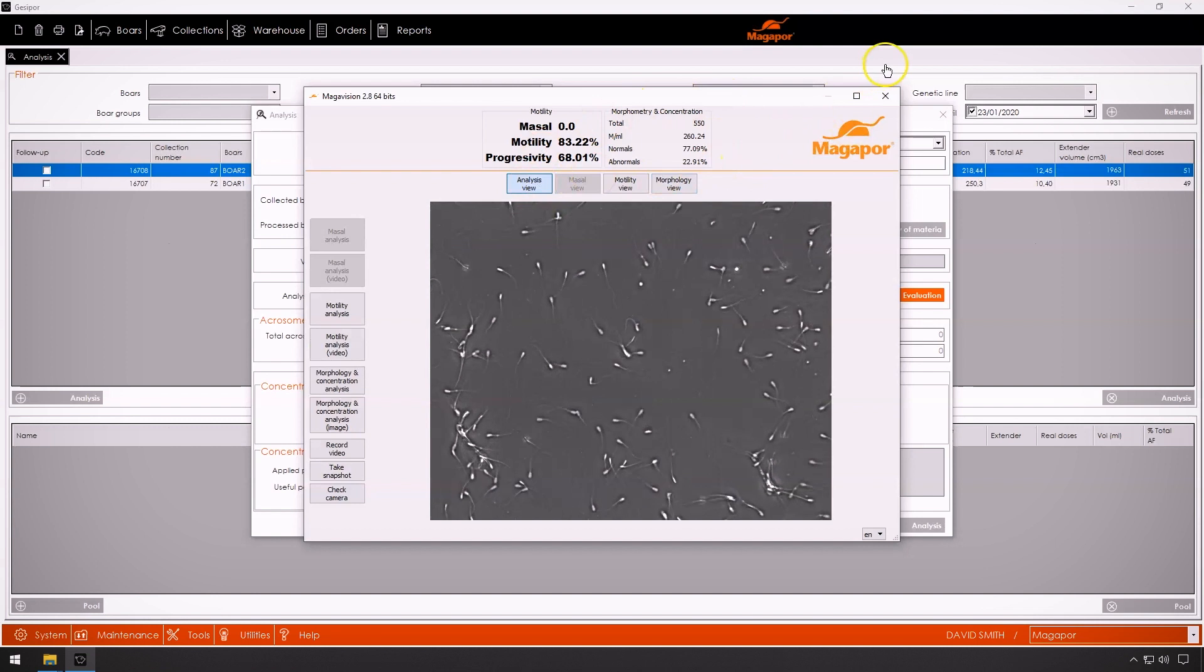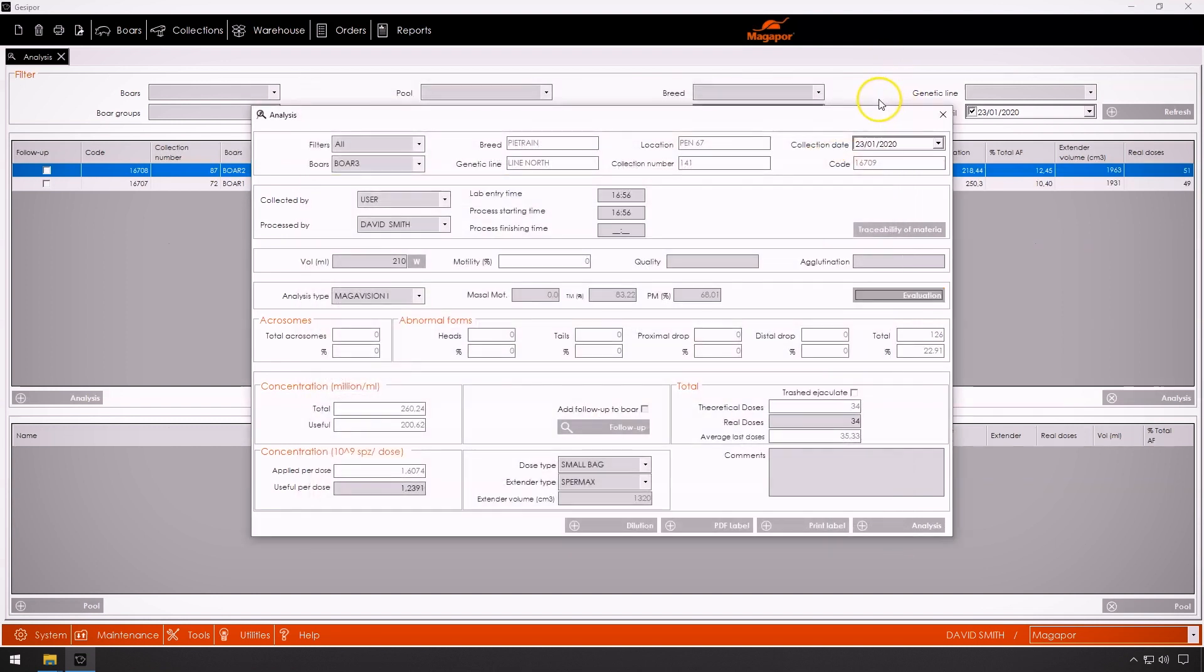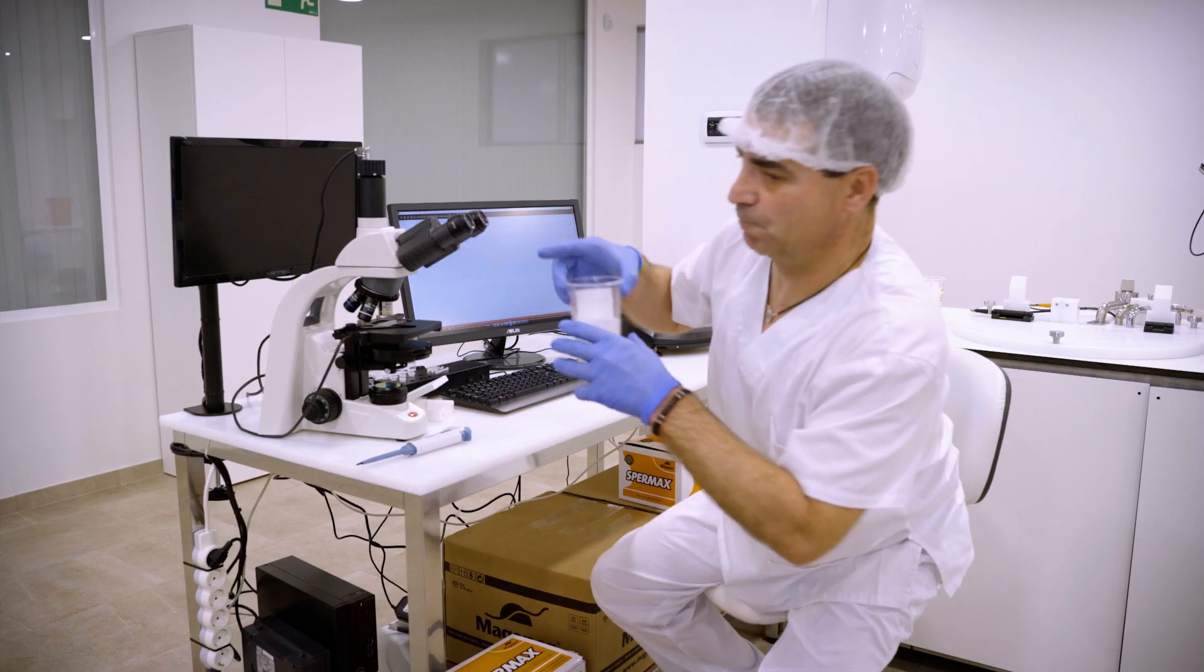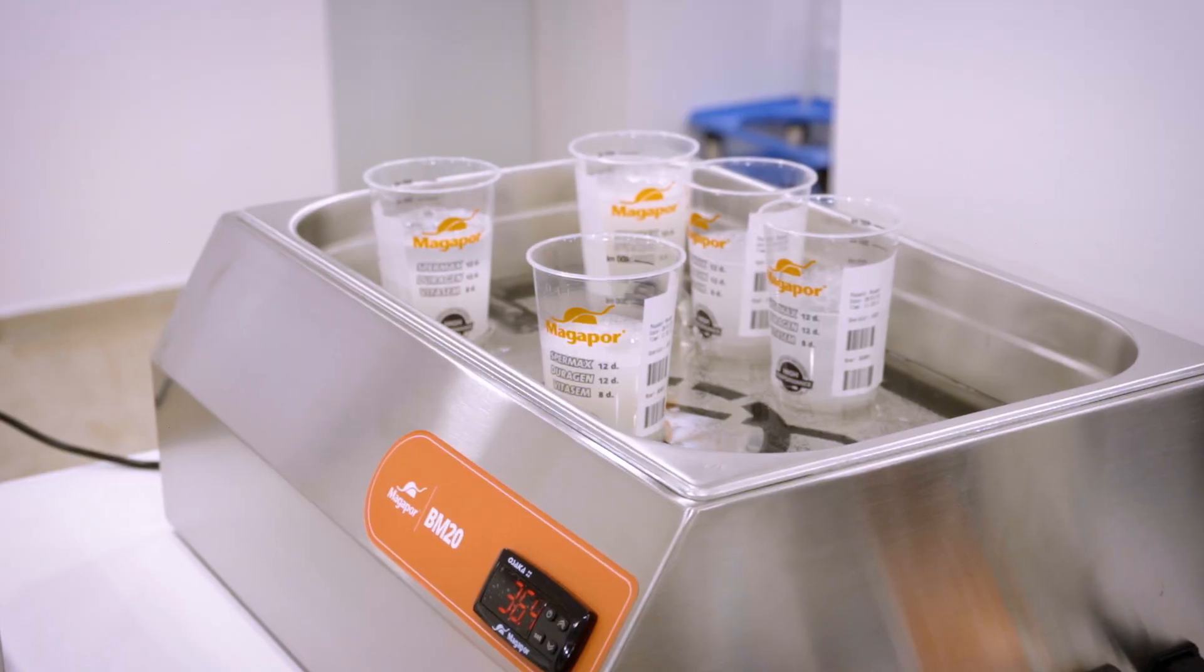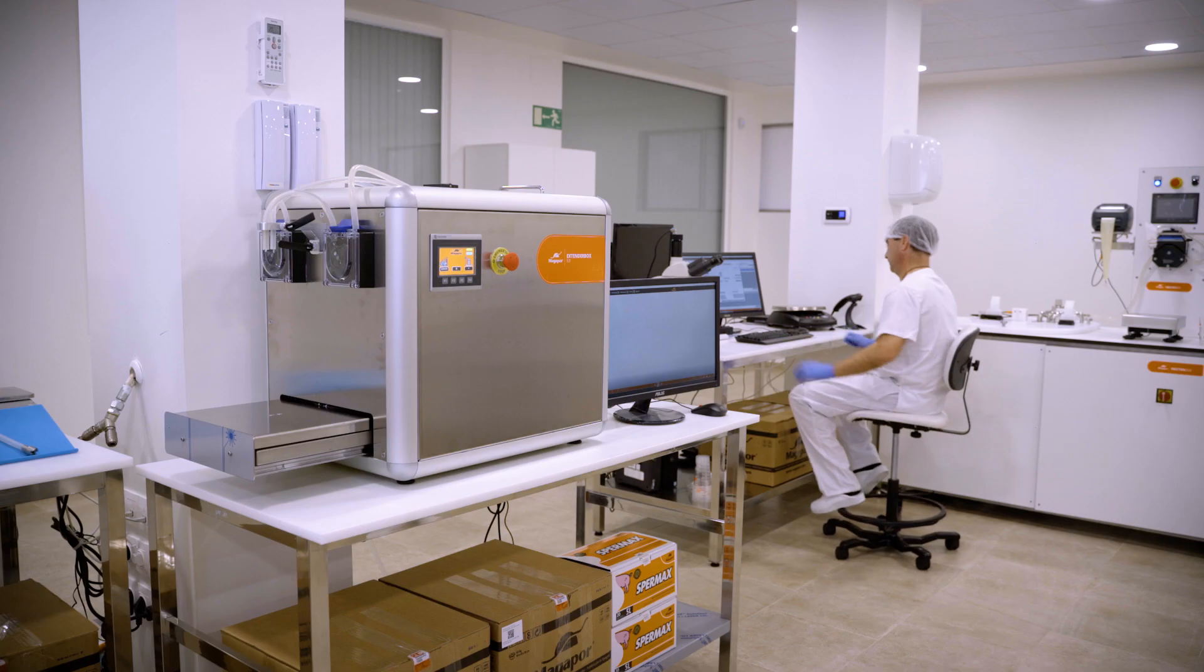Once the analysis is completed and depending on the parameters already configured, the information regarding the quality of the ejaculate analyzed passes to Gesipor, which shows the number of doses to be taken and the volume of dilution necessary and sends this information to the dilution and packaging unit.